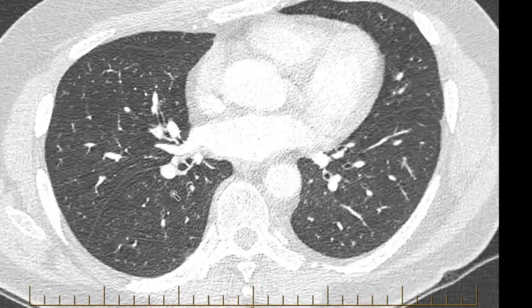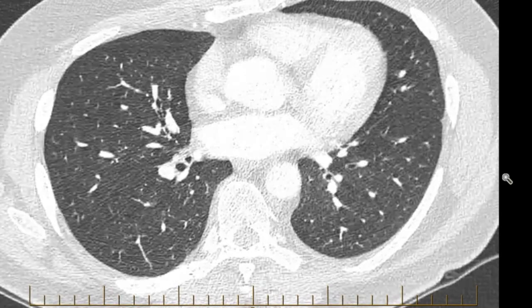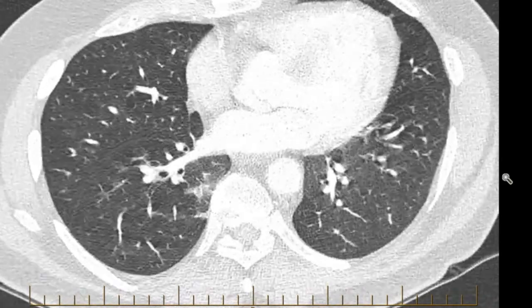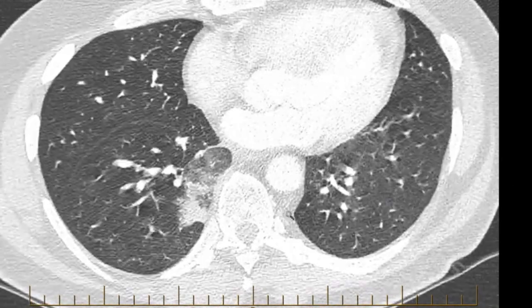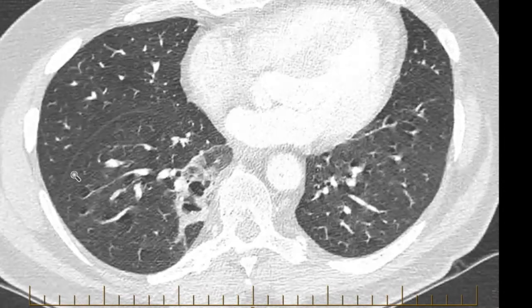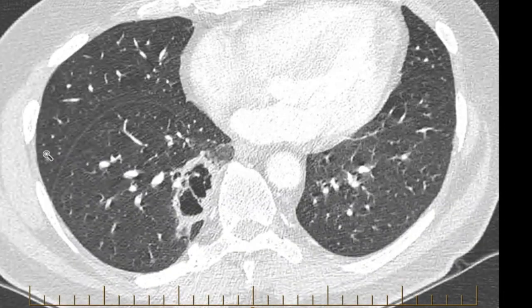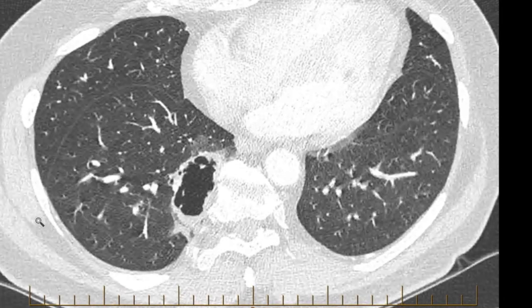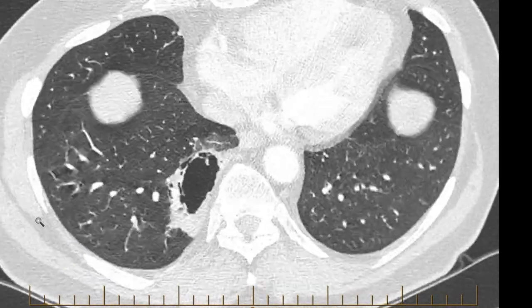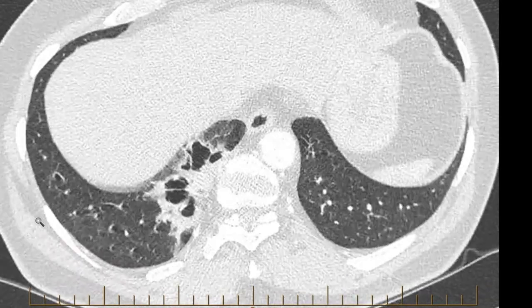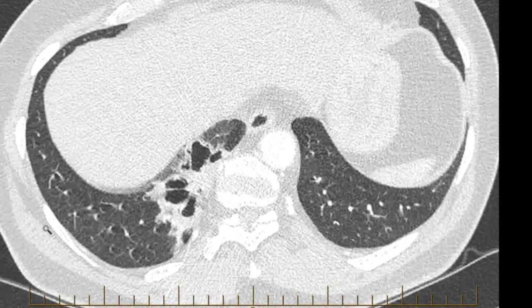we're looking down at the right lower lobe. As we scroll down, we see a significant abnormality just starting here. As we go further down, we can see there's a cavity with quite a thick wall. There's some septation through the cavity that extends right down to the costophrenic angle, which is the angle at the bottom of the lung near the diaphragm.